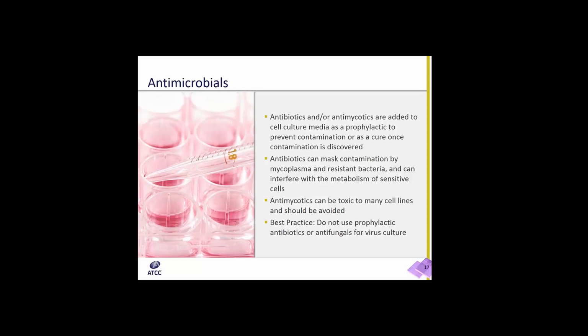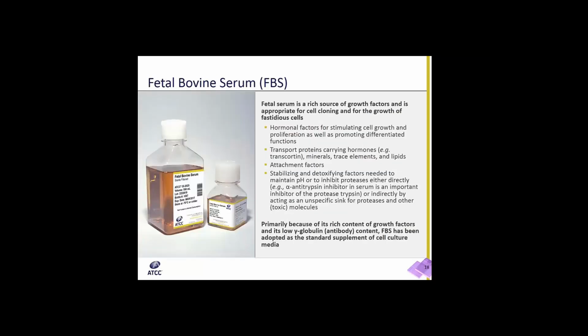Antimycotics can be toxic to many cell lines and so should be avoided. We recommend the best practice of not using prophylactic antimicrobials for virus culture or even cell culture prior to virus inoculation. It is best practice, if you find that your cell line is contaminated, to discard and start over with new stocks, because mycoplasma in particular is very difficult to eliminate and you may actually lose your cell line.